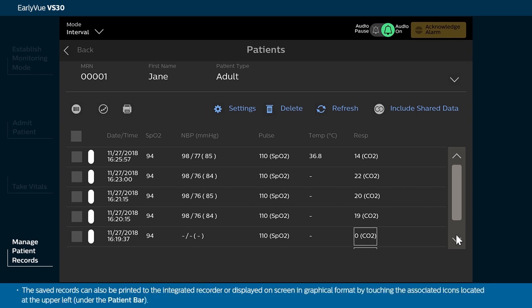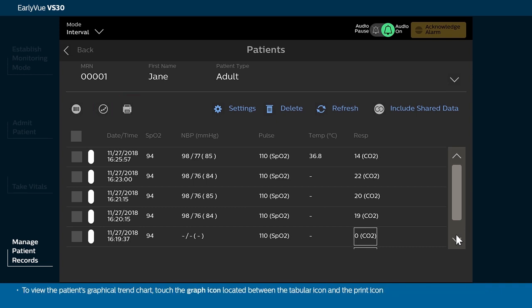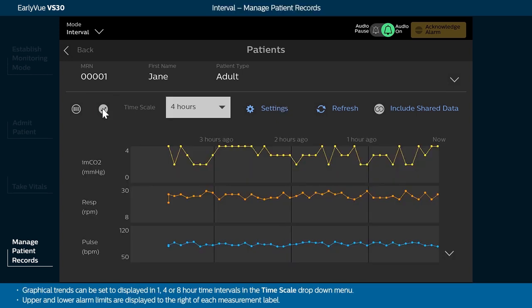The saved records can also be printed to the integrated recorder or displayed on screen in graphical format by touching the associated icons located at the upper left under the patient bar. To view the patient's graphical trend chart, touch the graph icon located between the tabular icon and the print icon. Graphical trends can be set to display in 1, 4, or 8-hour time intervals in the Time Scale drop-down menu. Upper and lower alarm limits are displayed to the right of each measurement label.